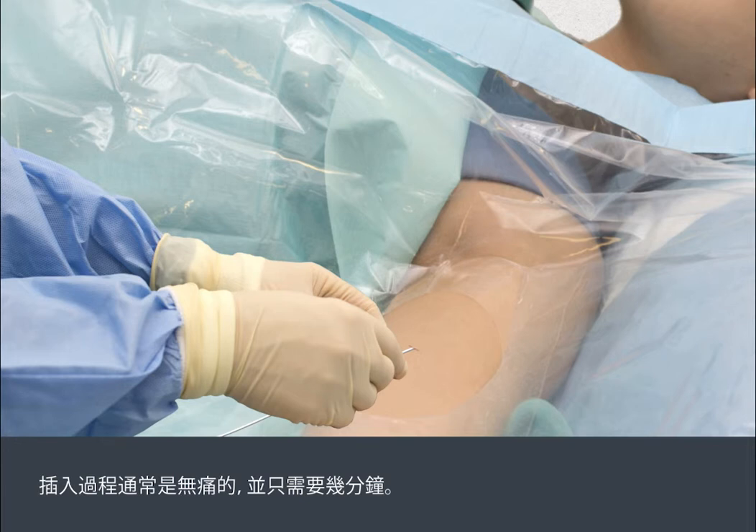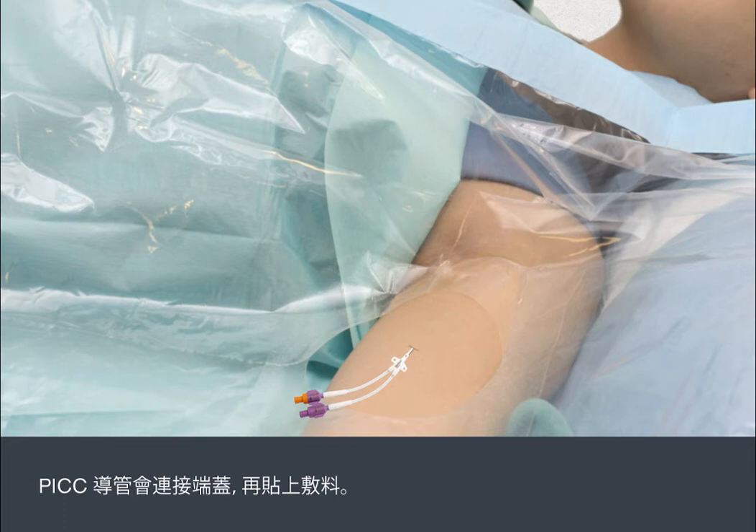The insertion is usually painless and takes only a few minutes. End caps will be attached to the PIC line, then a dressing is applied.